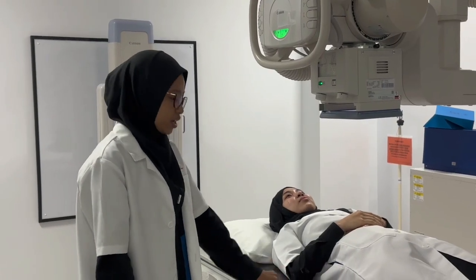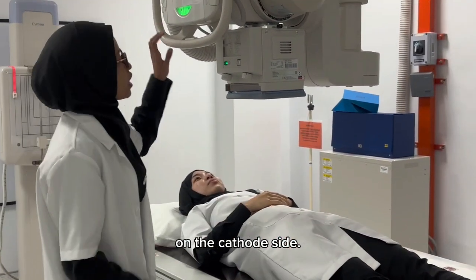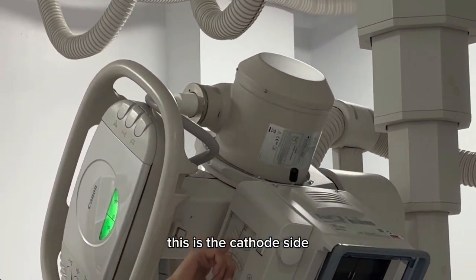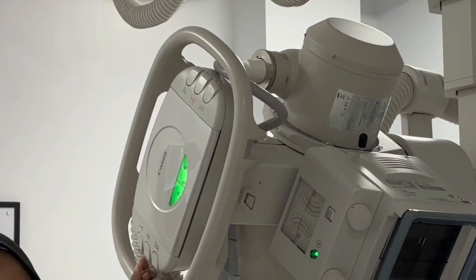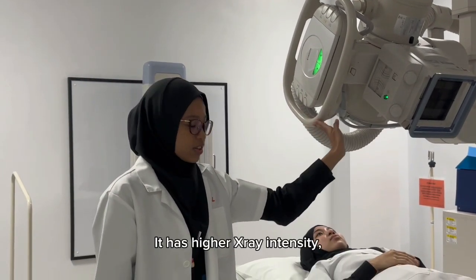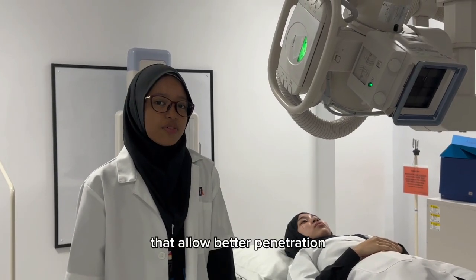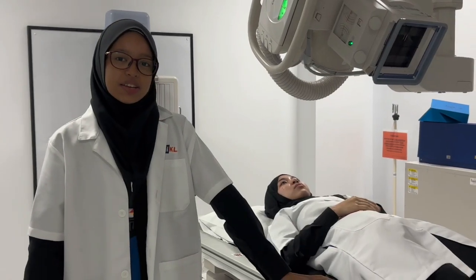For abdomen X-ray, we put the thicker side of the body on the cathode side. As you can see here, this is the cathode side. It is because the cathode side has a higher X-ray intensity, allowing better penetration and high image quality.